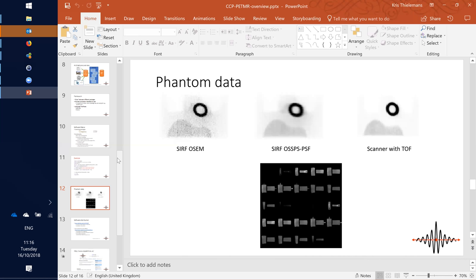I suppose vice versa, say, that's maybe longer term, to let CASToR read sinograms, so that's maybe not directly what we need to do. No, because for the moment we use other programs first to build the data lines. Right. But again, we need corrections. Sure. Yeah.